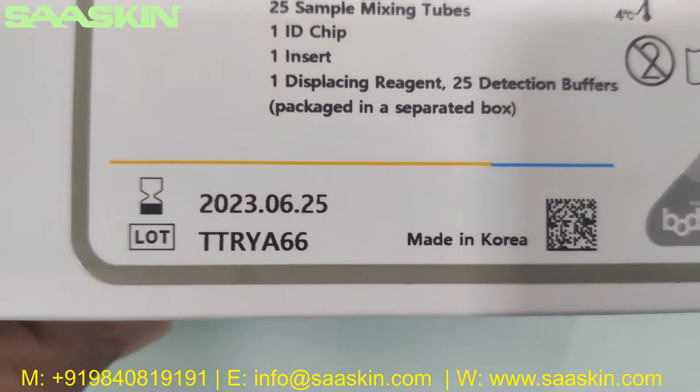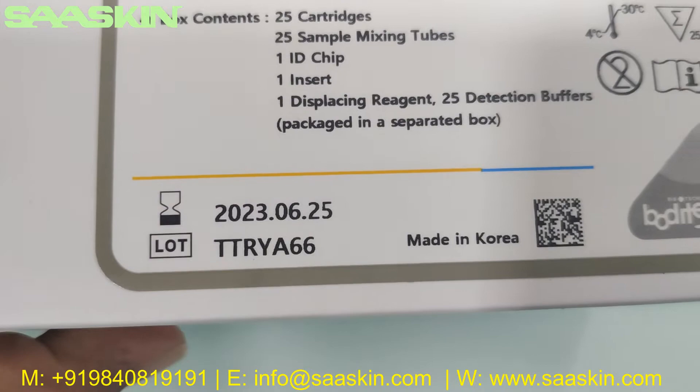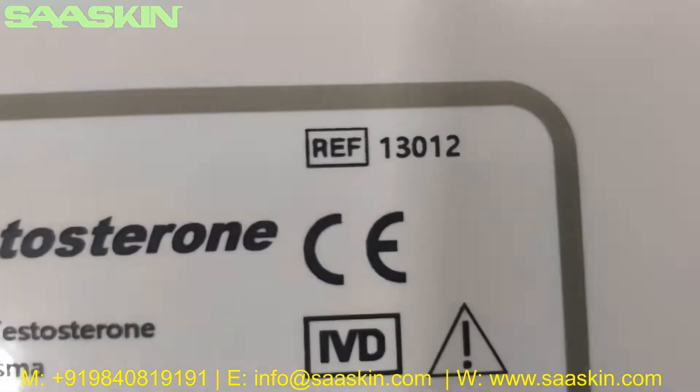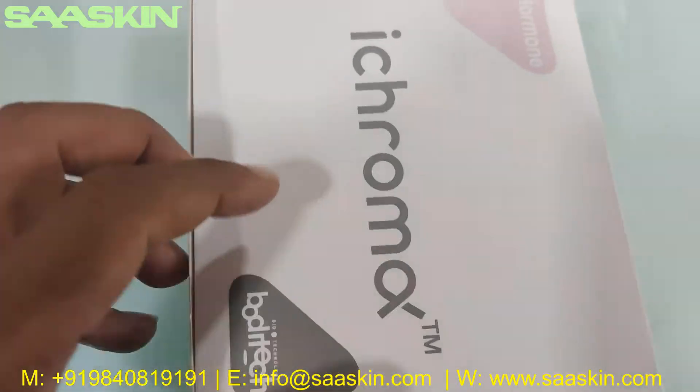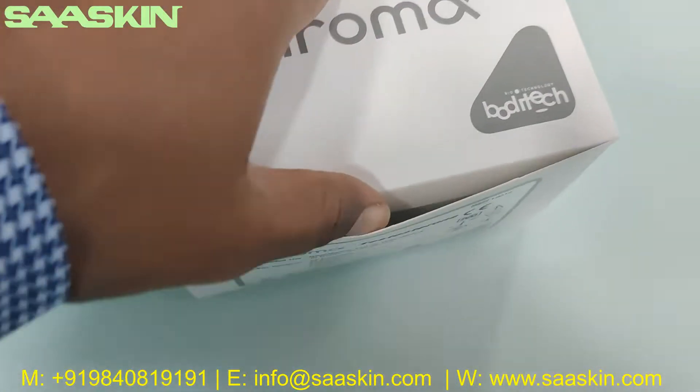You can review the expiry date, lot number, and part number reference on the box. Okay, let me unbox this for you.